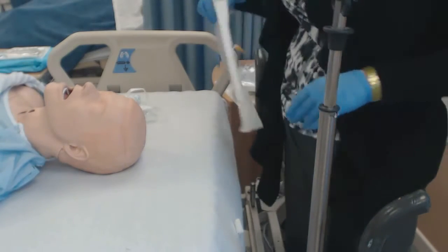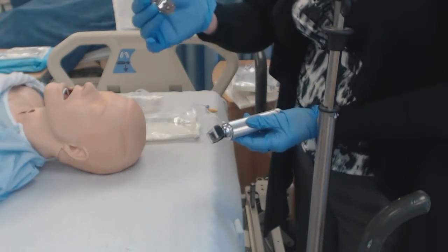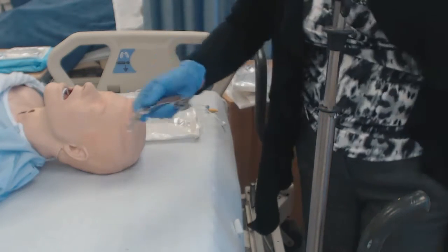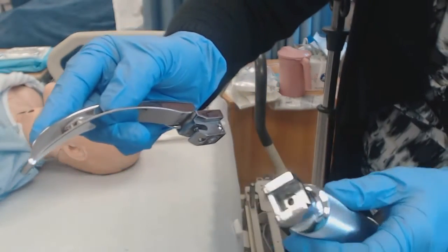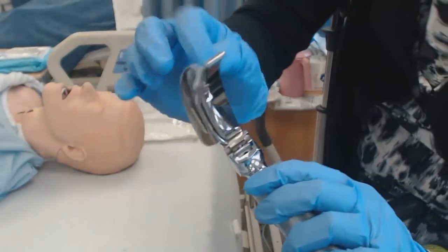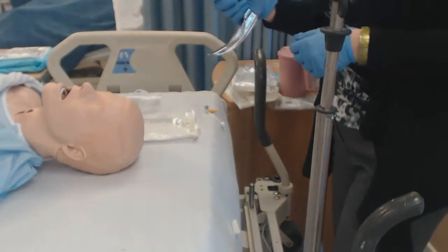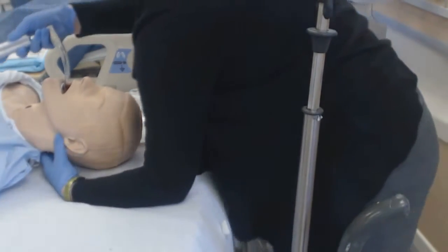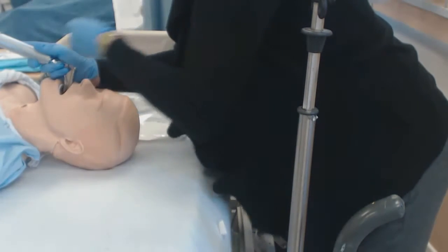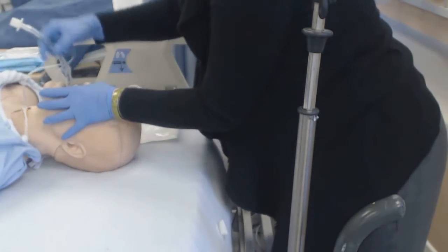Have the endotracheal tube ready. They may ask you for the laryngoscope — the laryngoscope comes in two pieces: the blade and the handle. They go together — sometimes the wrong way, but correct assembly shows the handle aligned properly. When assembled correctly, there's a light bulb that illuminates the patient's vocal cords so the doctor can visualize them.